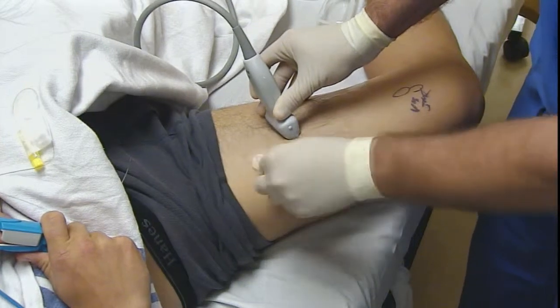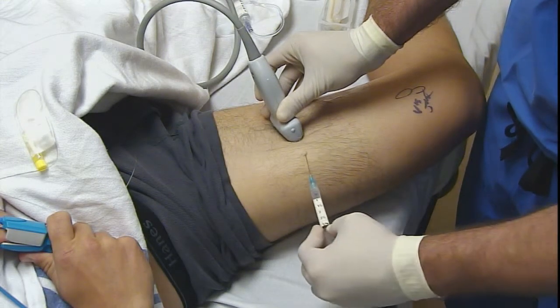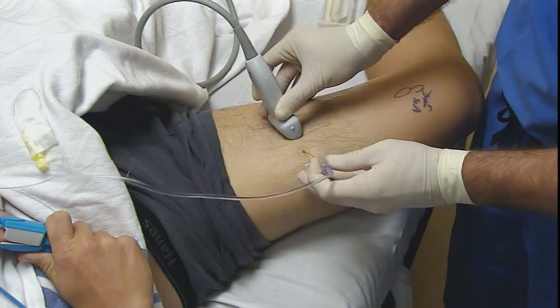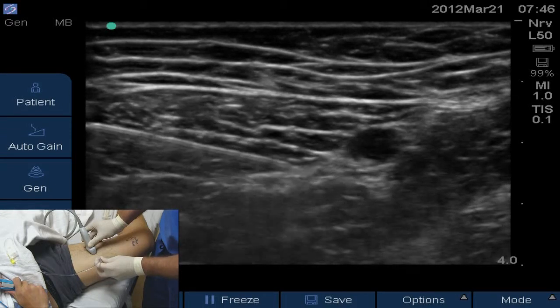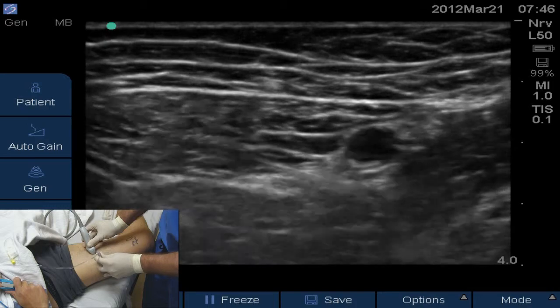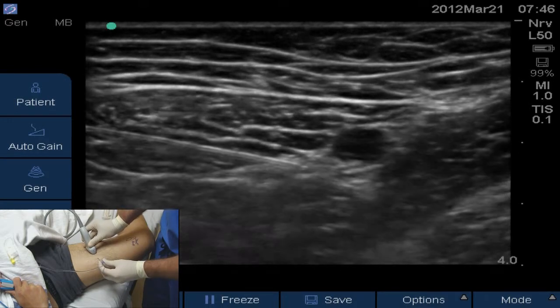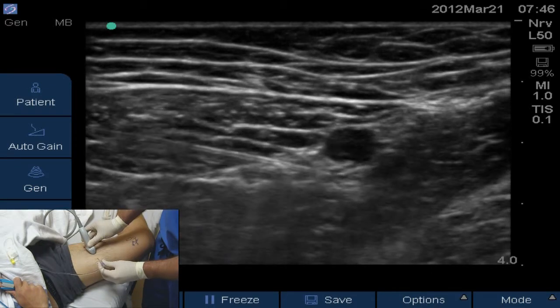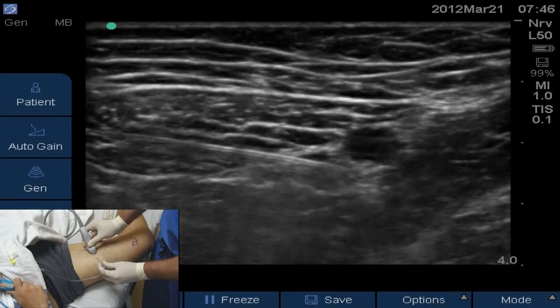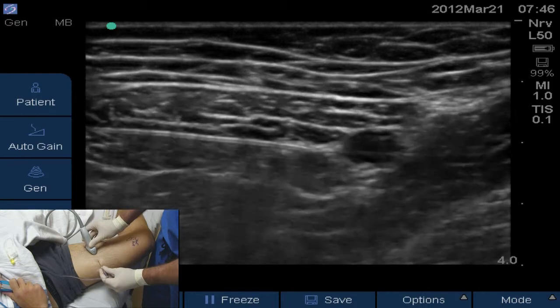Let's do a little chlorhexidine prep. Big bee sting. It's a 22-gauge two-inch needle. It's going to pop down below sartorius. We get a nice in-plane view of our needle. You can see the tip is just under sartorius, just under the nerve itself. We're going to aspirate and give two cc's — you might feel some pressure here, sir.